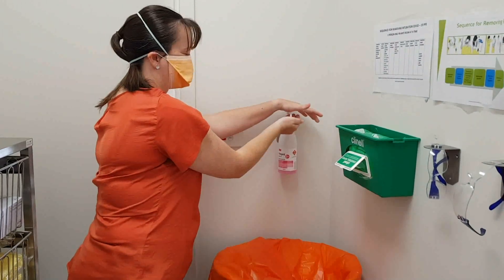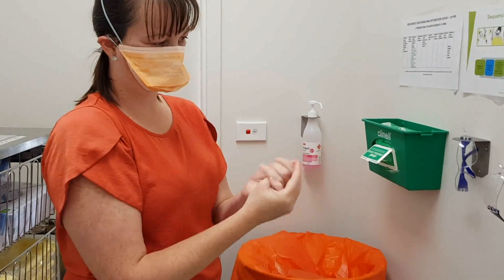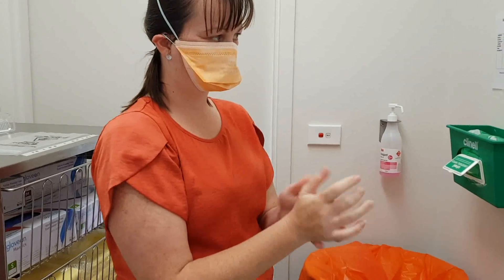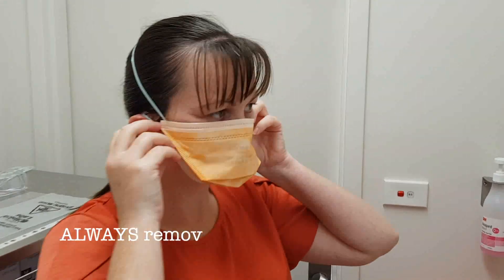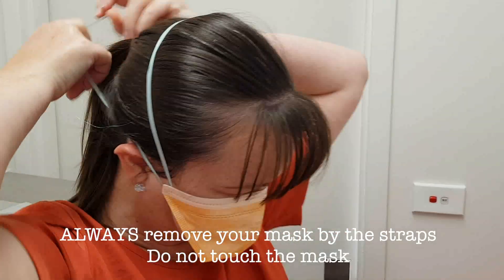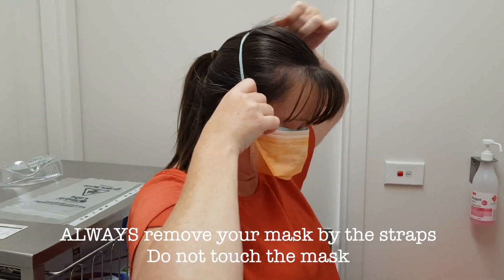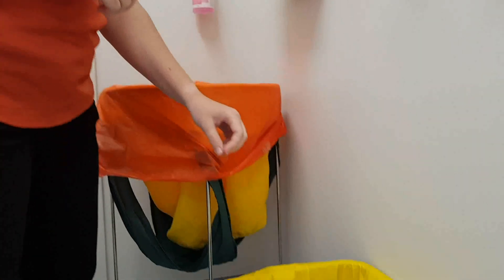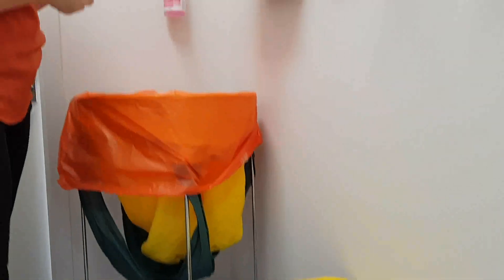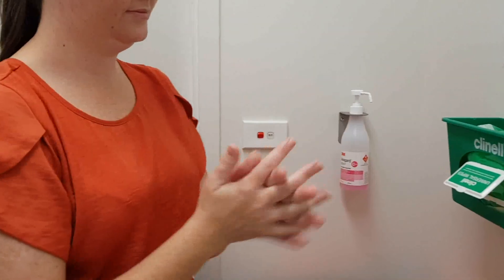Attend your hand hygiene again before you go to remove your mask so that you don't contaminate your face. Always remove your mask from the straps at the back of the head, not touching the front of the mask at all, which may be contaminated. Discard all PPE into clinical waste and then attend hand hygiene again at the end.